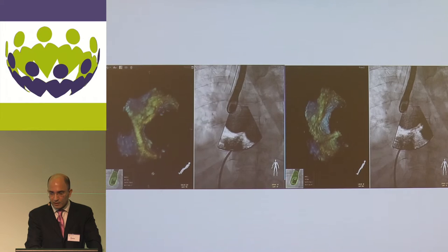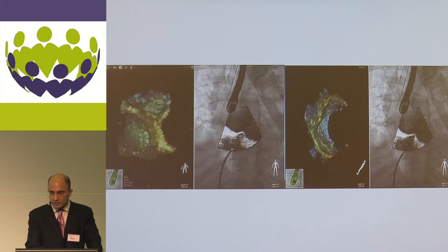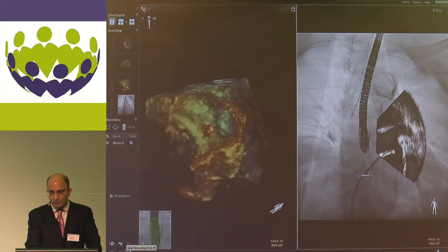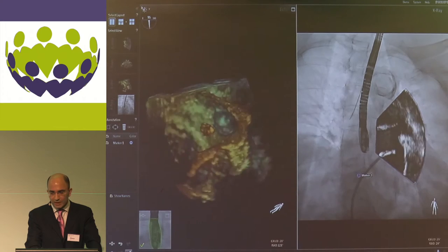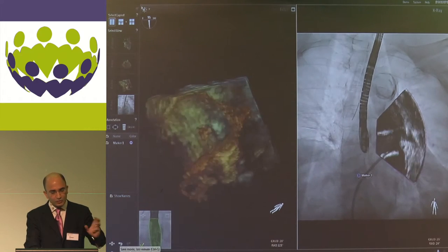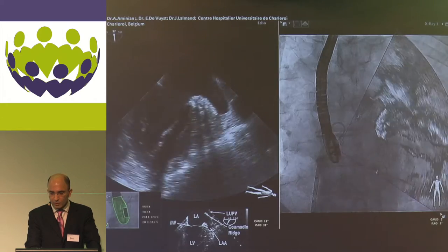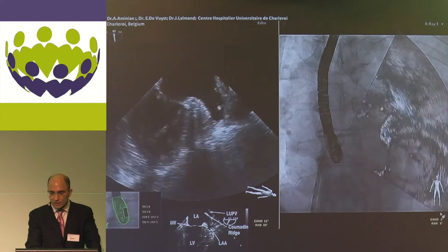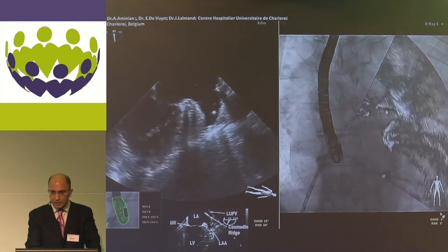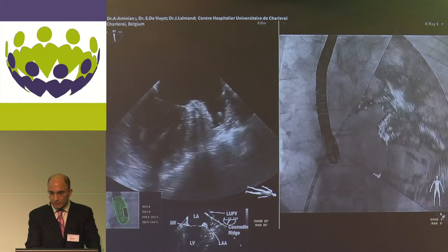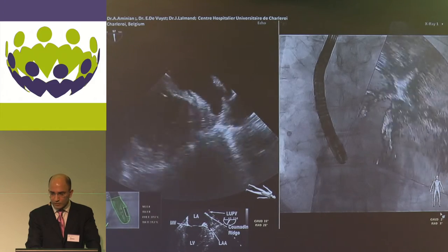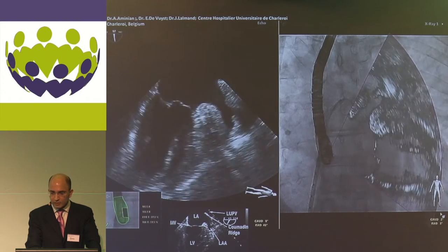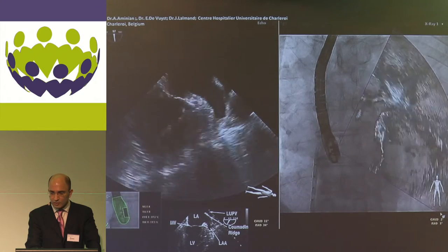We can see the needle crossing the septum without needing to ask the sonographer. Once the septum is crossed, the transeptal sheath is close to the appendage, confirming a good transeptal puncture with easy access to the appendage. You can go back from the 3D dataset to 2D and manipulate the system as needed. Another example shows placing the pigtail inside the appendage — we no longer need to ask the sonographer where we are. We can navigate into the left upper pulmonary vein and then correctly orient the pigtail to enter the appendage, gaining time during the procedure.